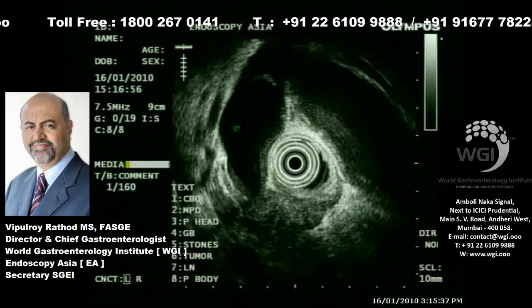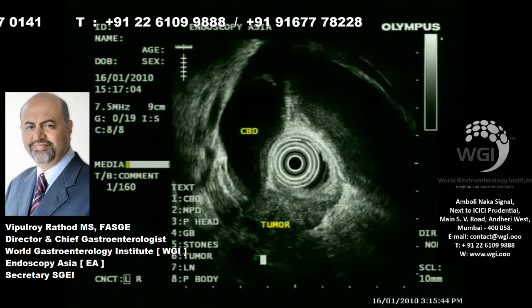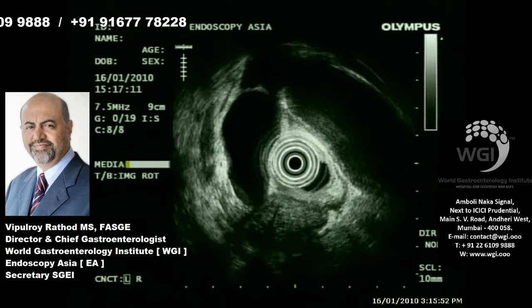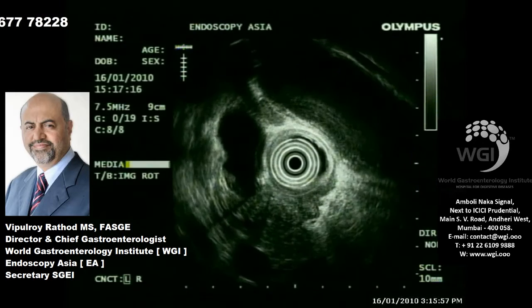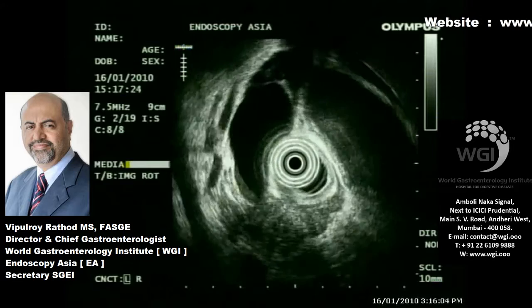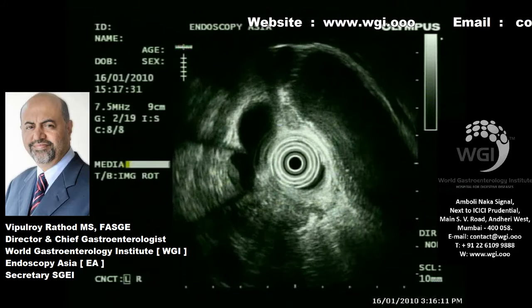You can see the dilated bile duct, and a periampullary tumor occluding the lower CBD. It could be arising from the pancreatic head. There's absolutely no doubt the lesion appears fairly resectable, as none of the major vessels are close to the primary lesion, as you can see here in scanning. However, minimal free fluid was seen in the pericholecystic area, and there were a few lymph nodes also.